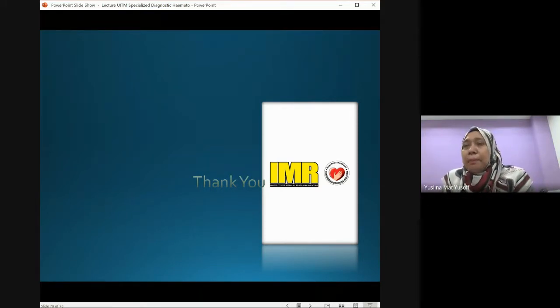Dan dia ada juga panel-panel yang kita buat juga, cytogenetic, kita FISH panel, semua tu boleh bantu. Tapi untuk lymphoma panel, kalau molekular ni dia tak ada banyak lah. So far kalau kat Malaysia kita tak offer, tapi kat overseas dia ada lymphoma panel yang guna PCR semua tu. Tapi kat Malaysia so far kita tak buat. Dia belum sampai that level.